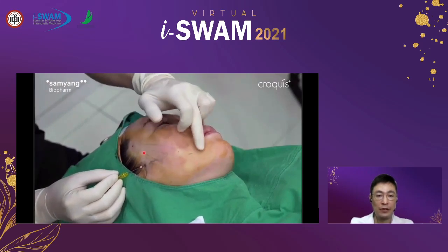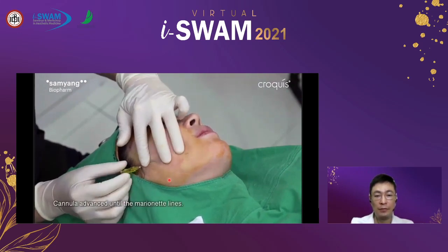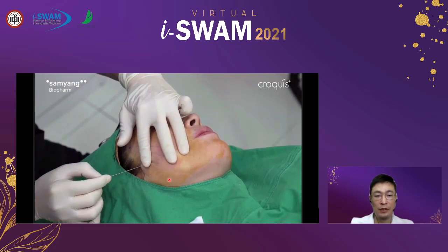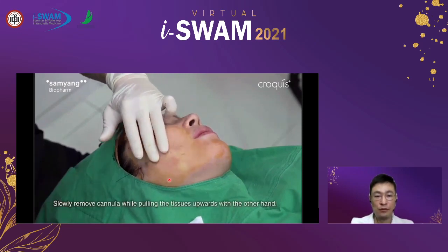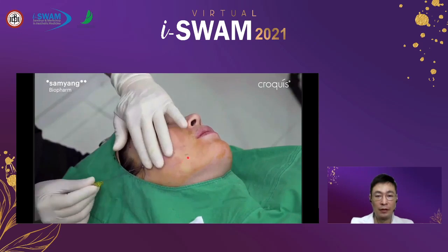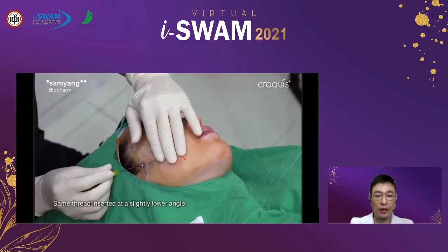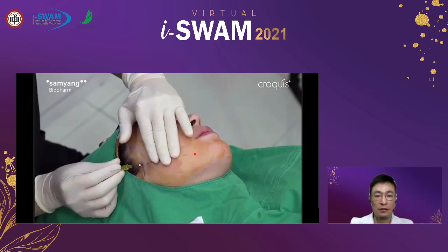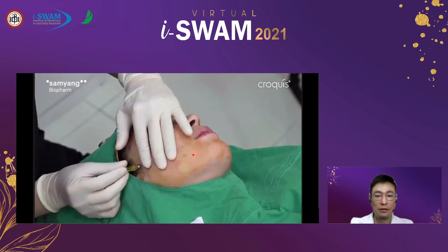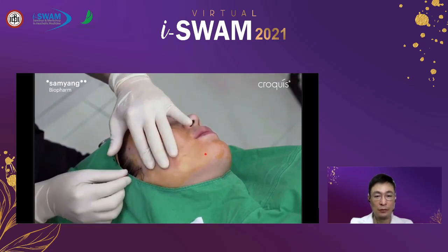And there is a parotid gland, as we all know. So you should keep the thread very superficially, I mean, very close to the dermis. Don't go deeper. And when lifting the jowl, you can advance up to the fold, but do not cross the fold.